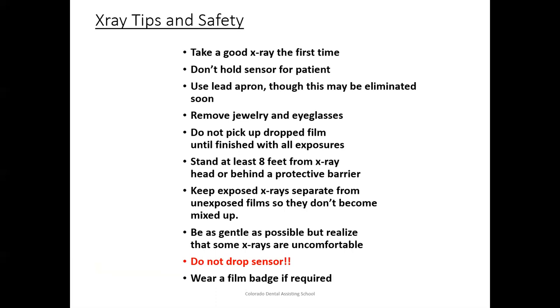If you're using film, an old film system, and you drop one, please don't pick it up with your glove and put it on the clean working space. Just leave it on the floor, and when you're done, you can pick it up and complete your films. If you have a sensor, under no circumstances is it okay to drop the sensor. And if you're wondering, well, what if I do? What if I make a mistake and I drop it? People make mistakes. We understand.